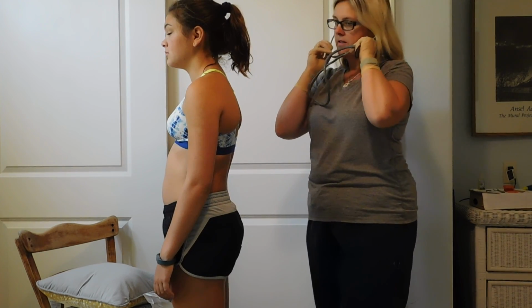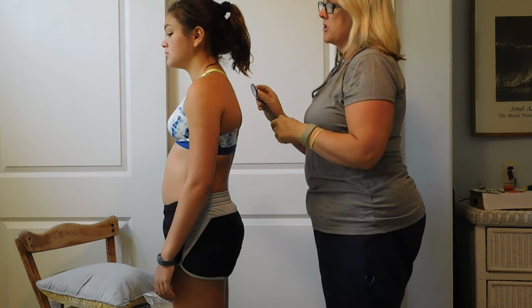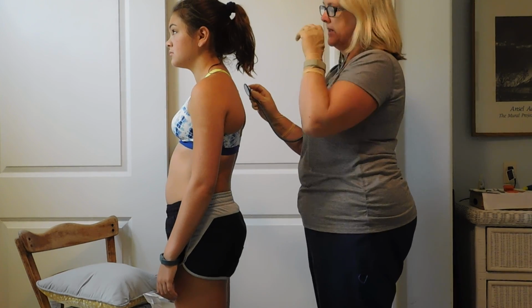Now I'm going to listen for breath sounds. Each time you feel my stethoscope, please take a deep breath.